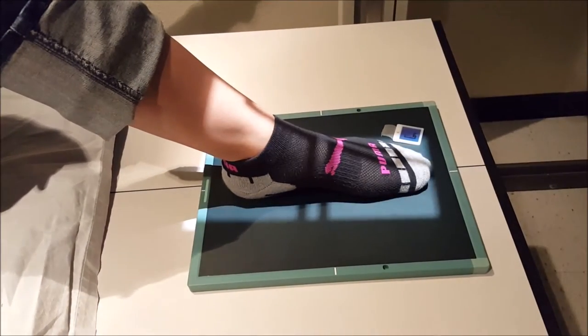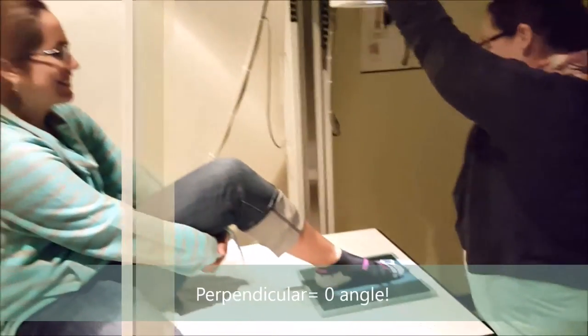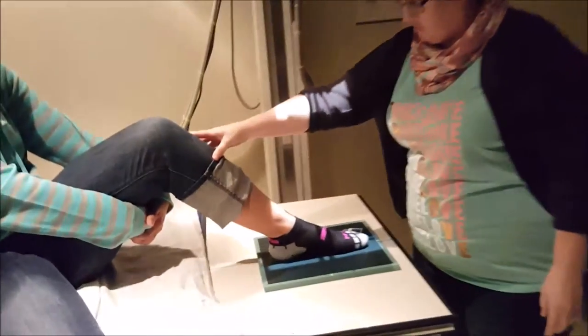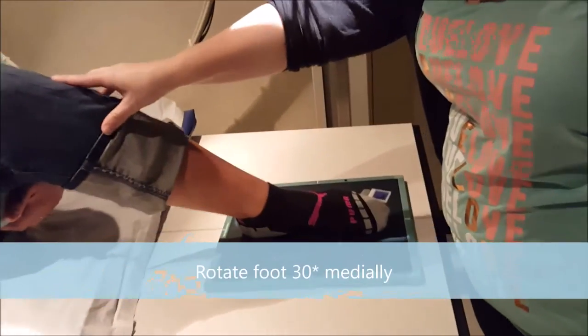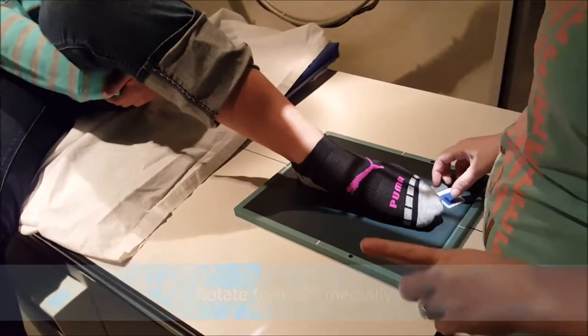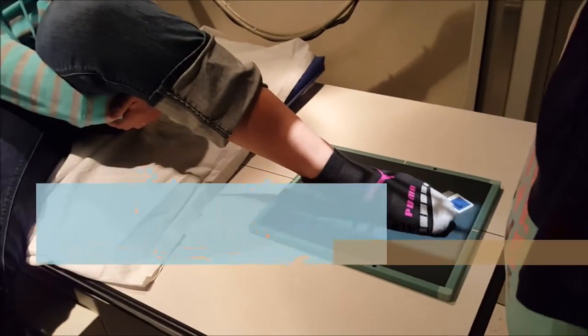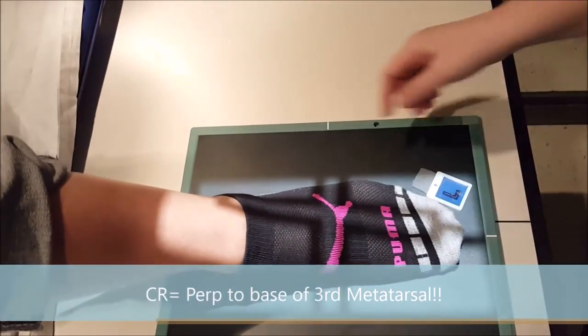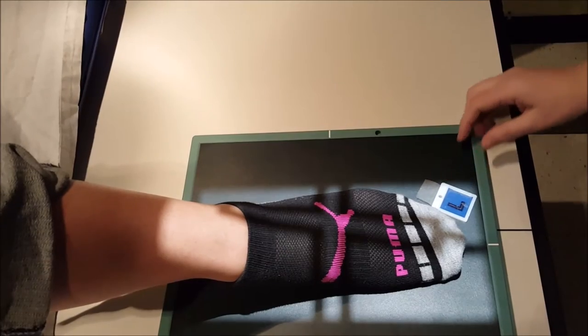For an oblique foot, we're going to take our angle off — there is no angle on the oblique foot. We're going to rotate the patient's foot in 30 degrees, not 45 — 30 degrees. You're still going to be centered at the base of the third MTP. Marker up in the corner.